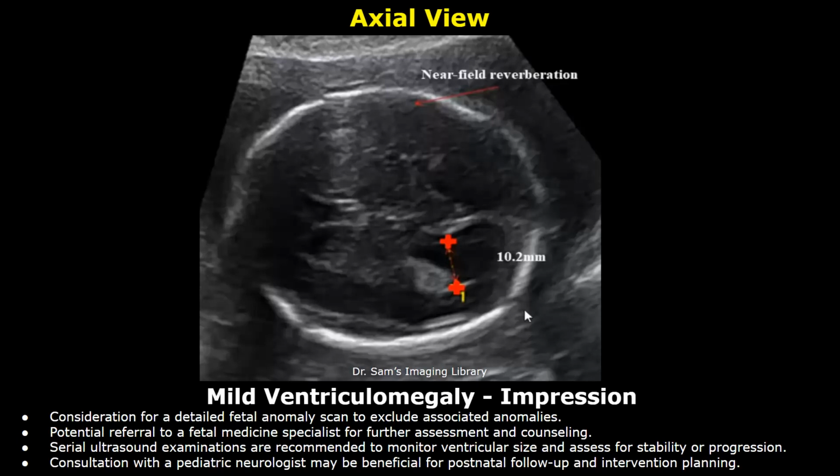Potential referral to a fetal medicine specialist for further assessment and counseling. Serial ultrasound examinations are recommended to monitor ventricular size and assess for stability or progression. Consultation with a pediatric neurologist may be beneficial for postnatal follow-up and intervention planning.